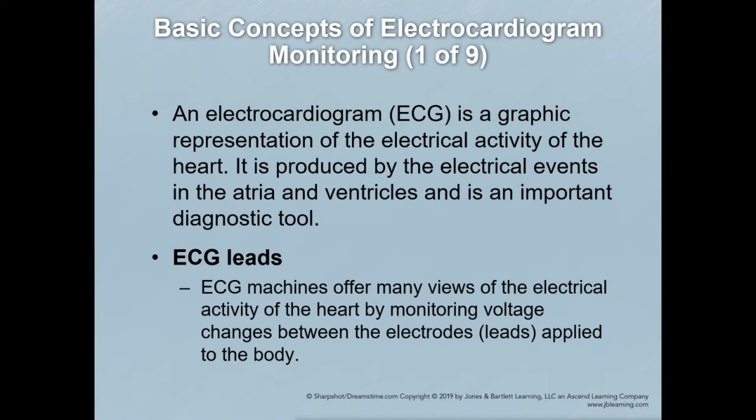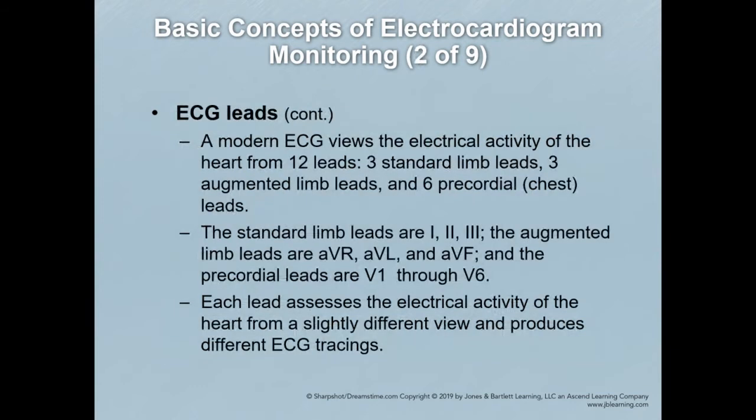EKG machines offer different views of electrical activity. We're going to be talking about those. And we're going to be talking about exactly how electrodes transfer that signal to us.